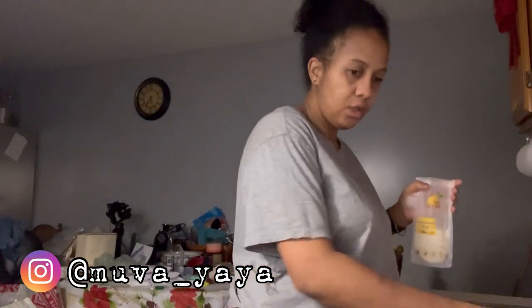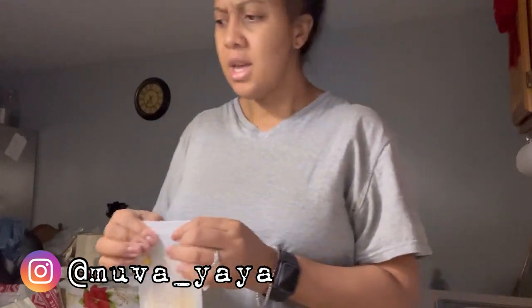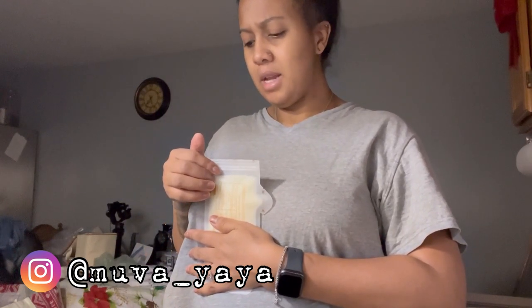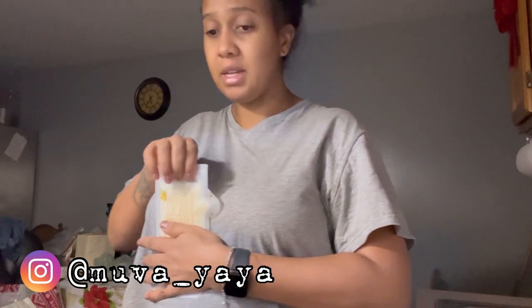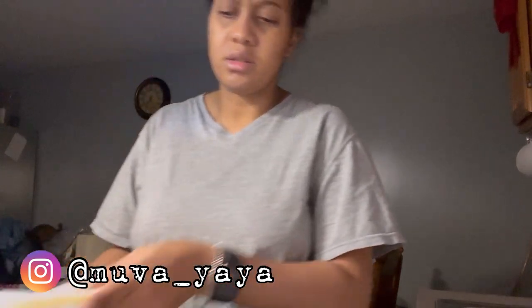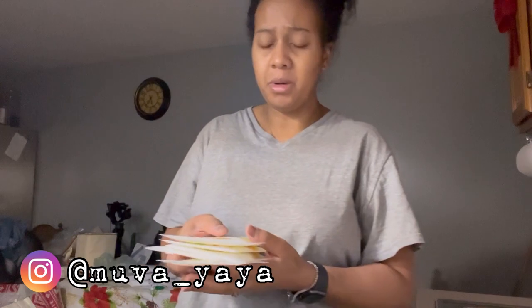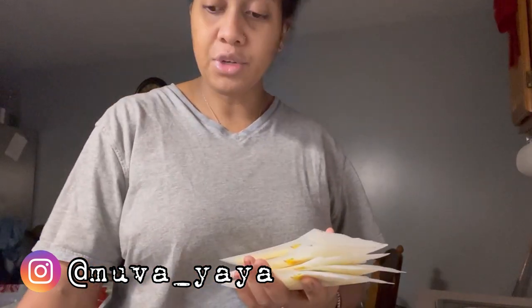This goes to wash and then these go back in the fridge for the later pump session. I'm actually very proud of this pump session — usually with hands-free pumps, this is my second hands-free pump trying different ones, and I usually don't get that much from both boobs combined. This is a really great pump session: 13 and a half, so about 14 ounces. 14 ounces — one pump session. Let's go!